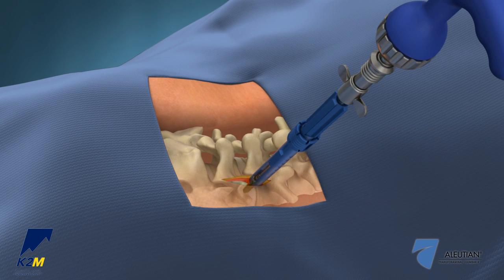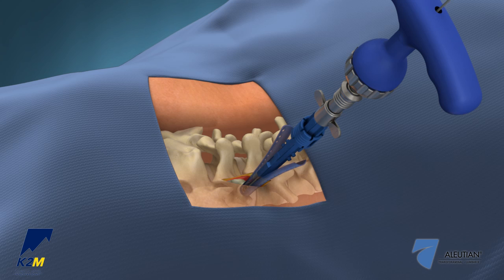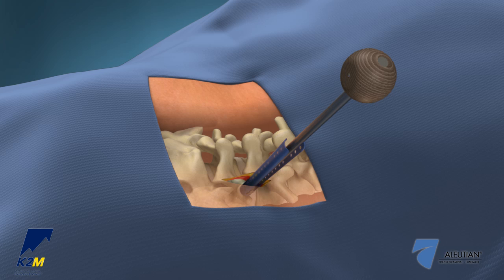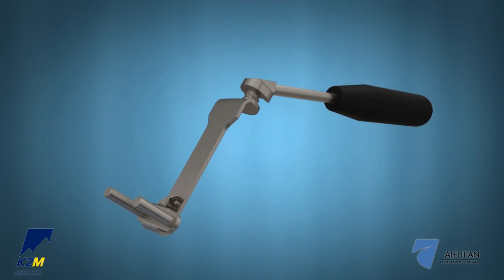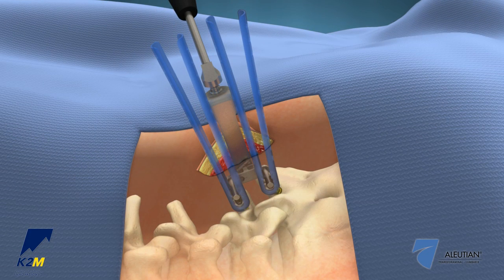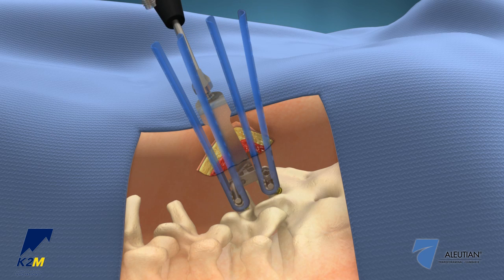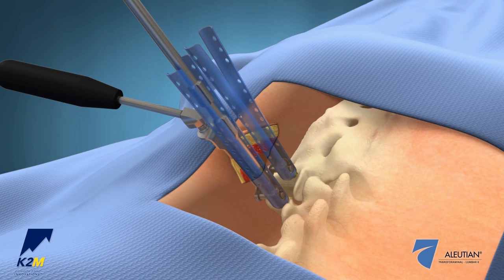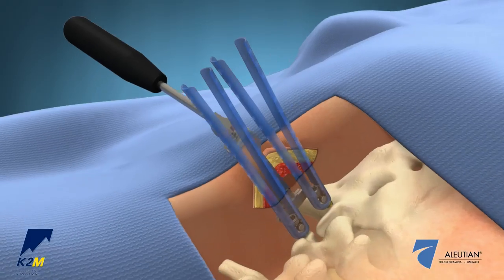Once the appropriate screw has been selected and inserted, use the MI head adjuster to rotate the retractors and screw saddles into a medial lateral orientation. Attach the blade holder to the retractor distractor blade and insert the blade into the screw heads. Provisionally tighten the set screws into the screw heads using the provisional screwdriver to secure the retractor distractor blade to the spine. For optimal access to the disc space, pull the blade handle laterally and tighten one of the set screws to lock it in place.